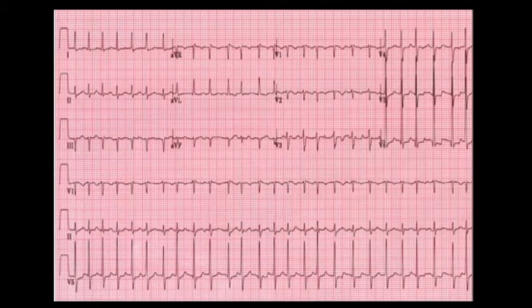This ECG shows a narrow complex tachycardia that is grossly irregular. Look for the longest RR interval to inspect the baseline for the presence of F waves. Although the baseline in atrial fibrillation varies from being completely flat to coarse fibrillatory waves, F waves have a consistent and distinct appearance that should allow you to distinguish atrial flutter from atrial fibrillation.